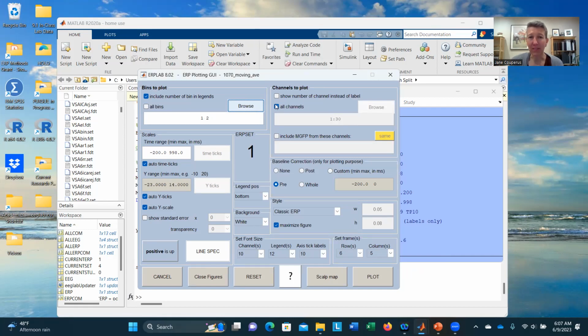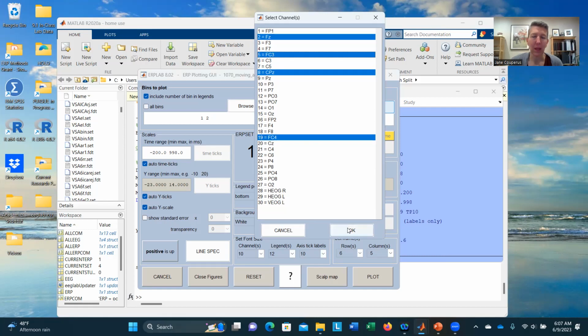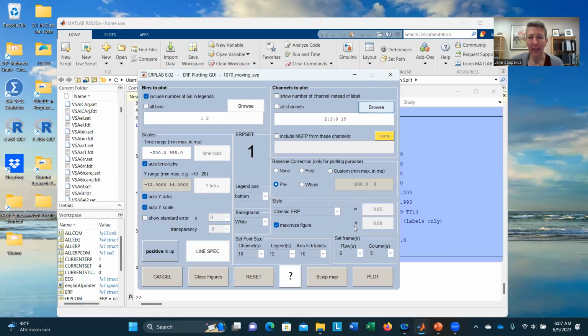You might not want to look at every single channel, every single electrode. So maybe I really only am interested in CPZ and let's see, FZ, maybe FC4 and FC3. Maybe I'm only interested in 4. Go ahead and click OK. And so if I'm only interested in these 4 and these 2 bins, the default is to have 6 rows of electrodes and 6 columns of electrodes, or 5 columns of electrodes, because then you get 30 on the screen. We only have 4, and I don't want to see them that small. So I'm going to go ahead and reset this and just say, make this frame 2 by 2. And that's just how many different boxes do you have on the screen.